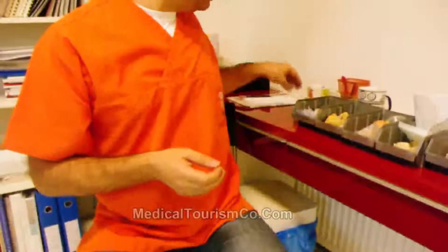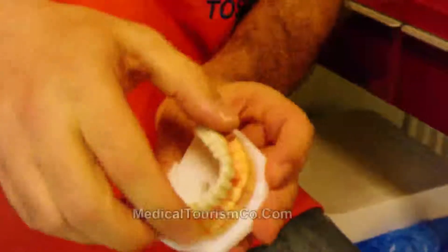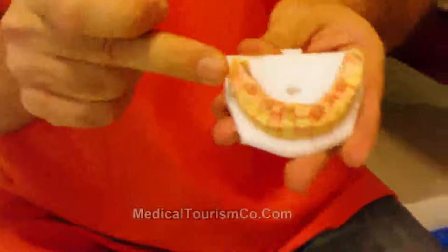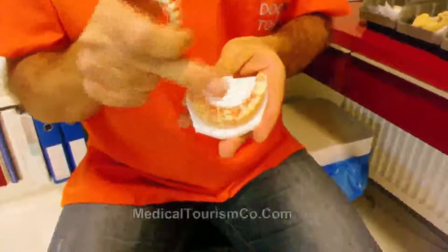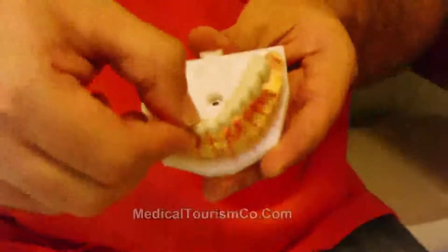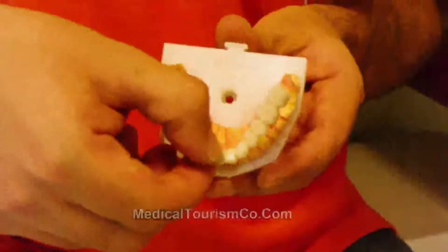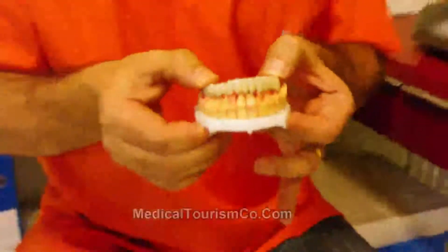With implants we can do full mouth reconstructions also. This is a model of the lower jaw reconstructed with six implants — six abutment implants. This is a stone model of the mouth, and this is a bridge work made on top of only dental implants, so the patient has a fixed bridge.